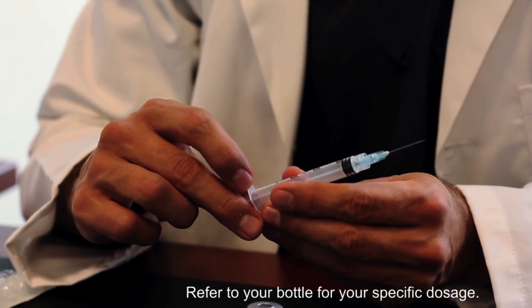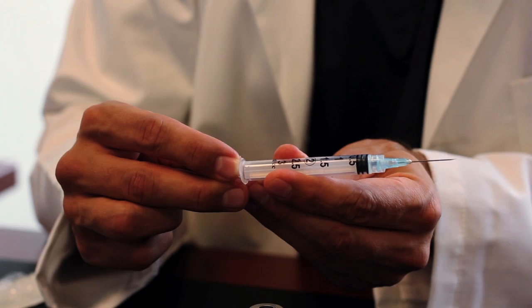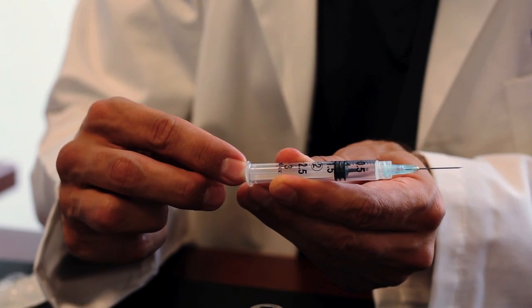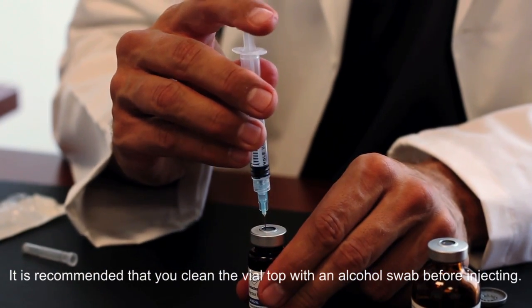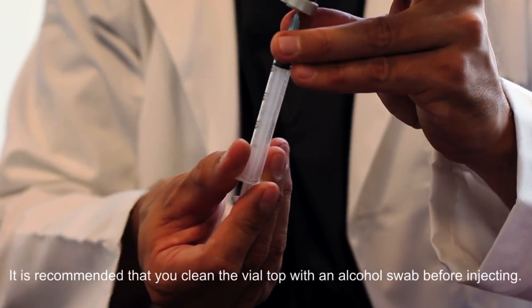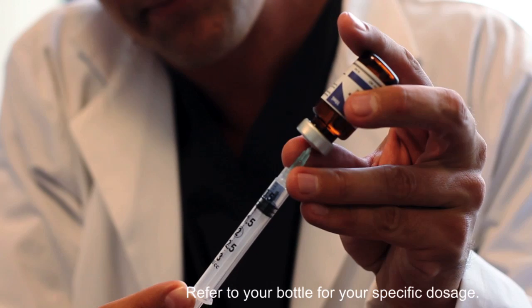So like always, we want to equalize the air pressure. Use this needle and pull the plunger back exactly to 1 milliliter. Put the needle into the testosterone and push in the air. Invert the needle and the medication, and slowly pull back exactly to the 1 milliliter mark.